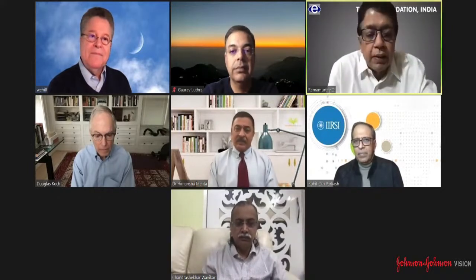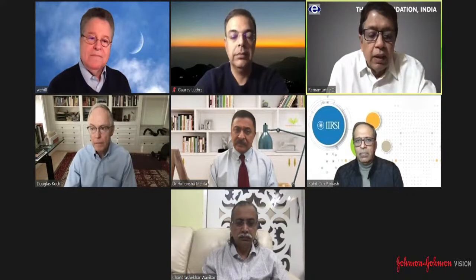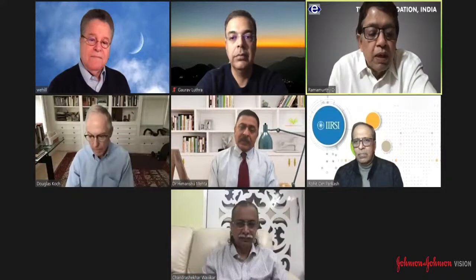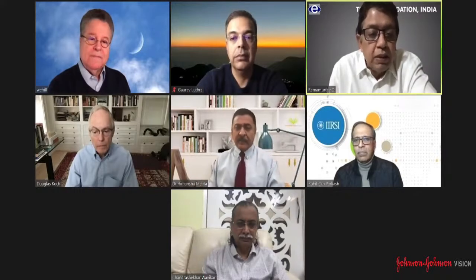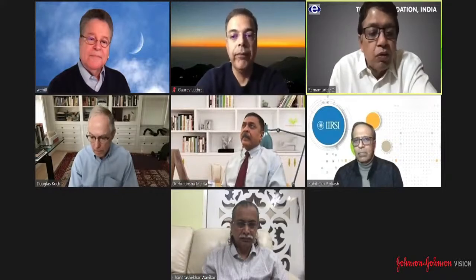Dr. Hill, I just want a clarification regarding your concept of out of bounds. I think it's a great concept. But with your Hill RBF3 iteration, I think most eyes that we come across in our clinical practice will be within the boundaries. In case there is a case which is out of bounds, for most formulae it's again going to be out of bounds, because these extreme eyes are what are challenging. Is my understanding right that out of bounds just means that the 90% chance of landing within my 0.5 diopters is not there? And even in these situations, for want of anything better, you can go ahead and use your formula.